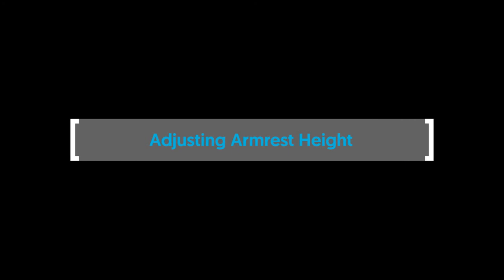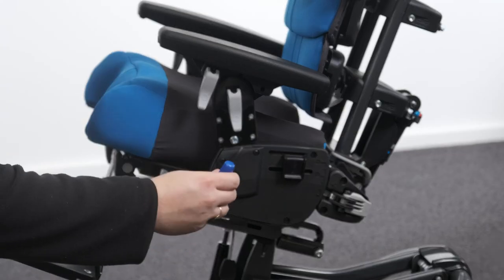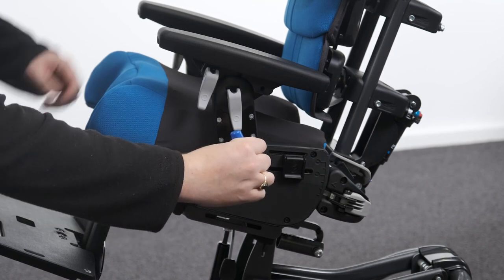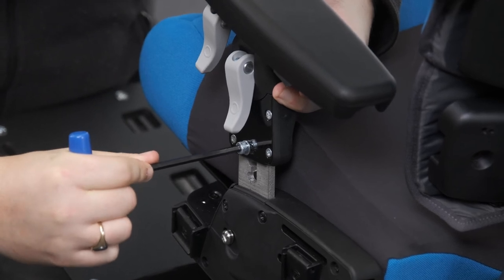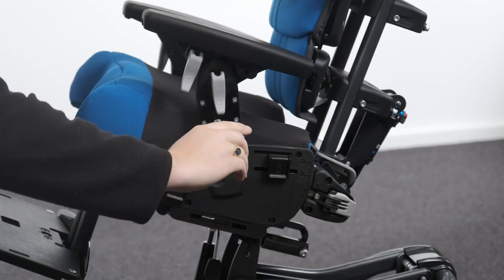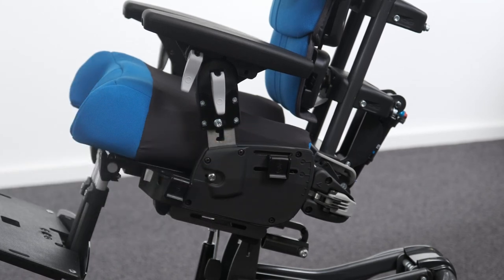Adjusting armrest height. The armrest can be adjusted into several incremental height positions. To adjust the armrest height, loosen the bolt which rests off-centre from the midline of the plate. With the end of the tool still in the bolt head, slide the bolt across to the other side of midline, which will allow height adjustment of the armrest up and down. To secure, slide the bolt head back to the original off-centre position into one of the several incremental height positions and tighten the bolt to secure in place.